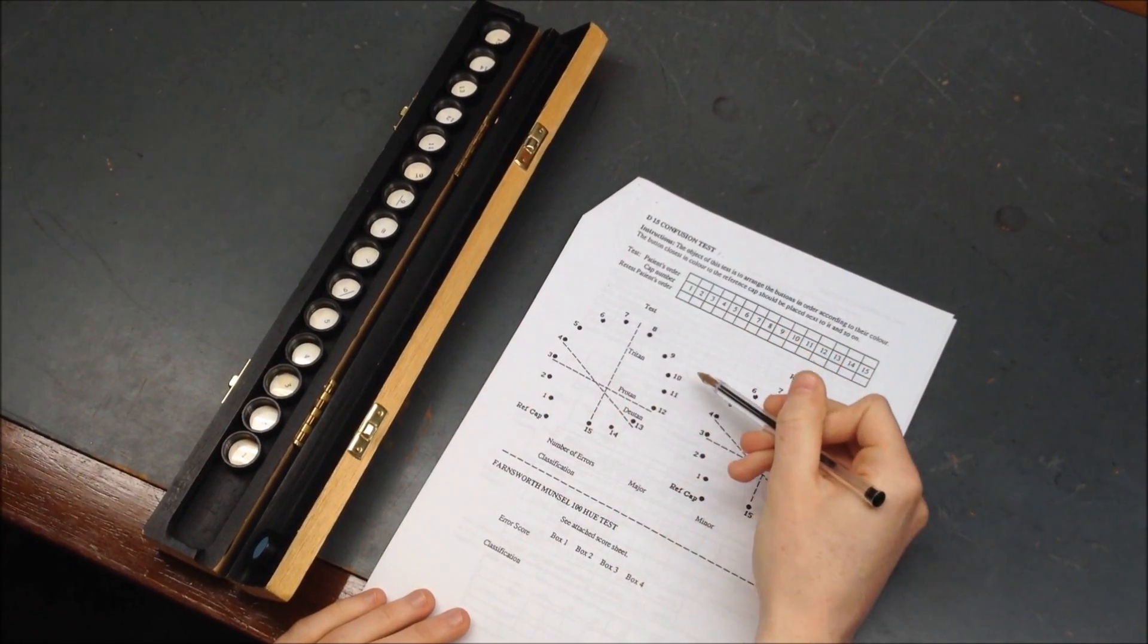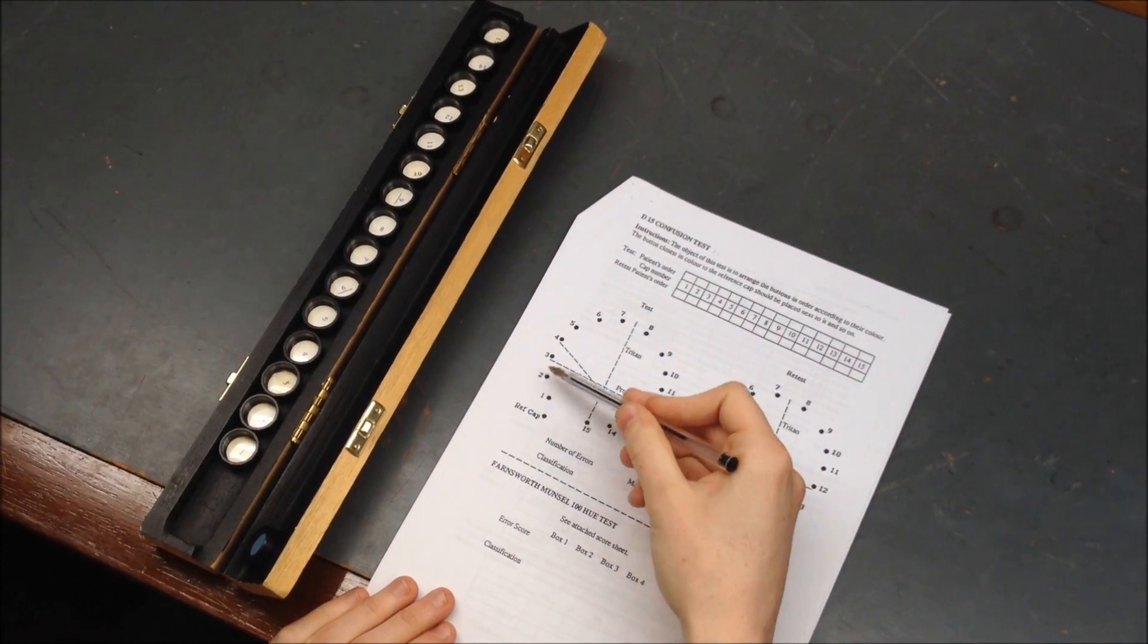So it would just follow around like this. In Tom's case he made no mistakes so it would go all the way around.